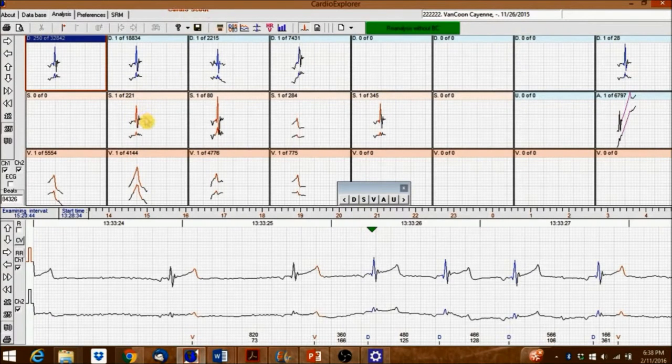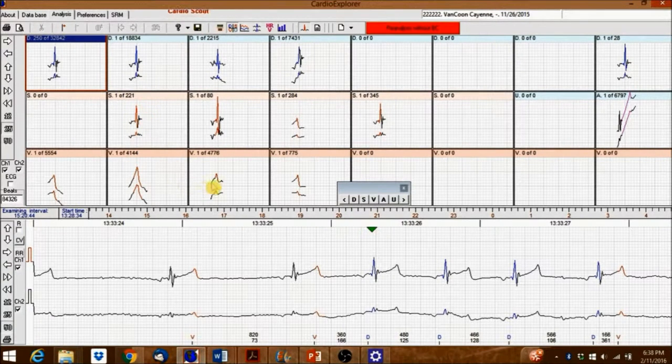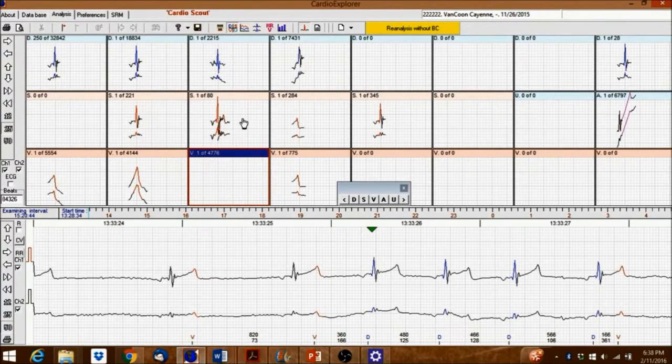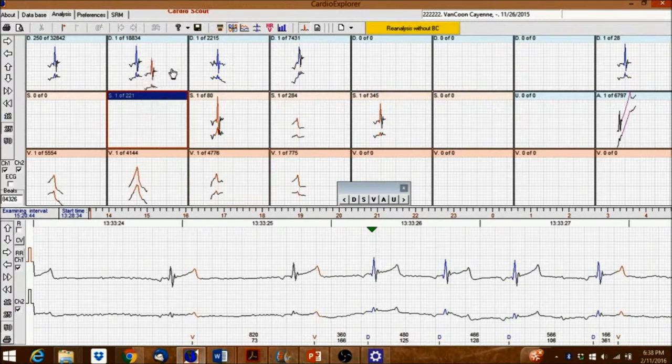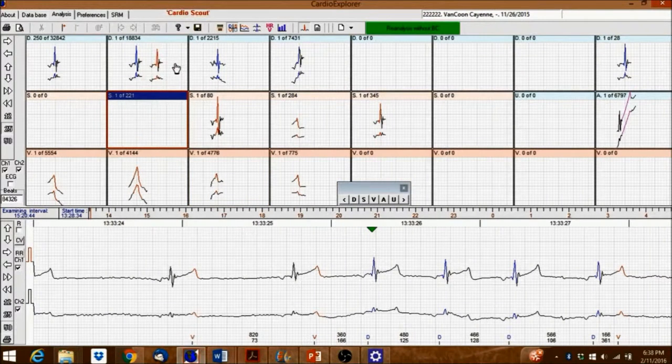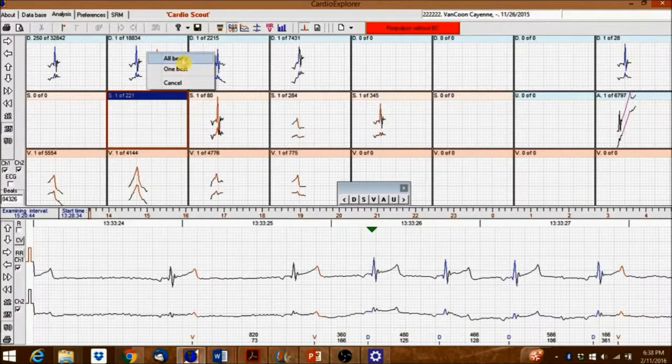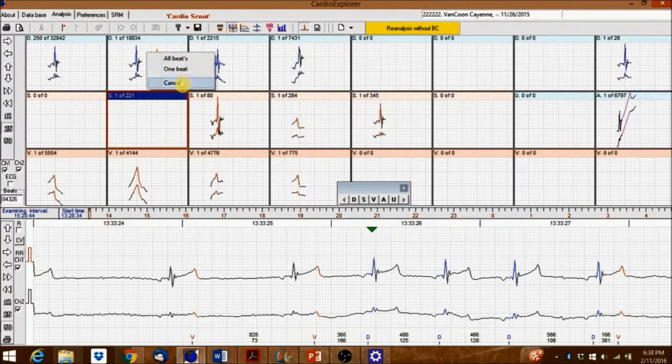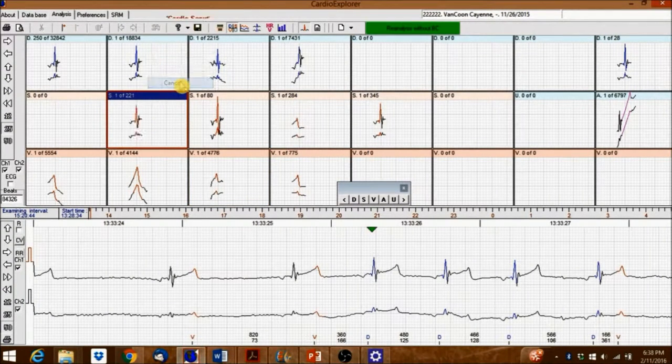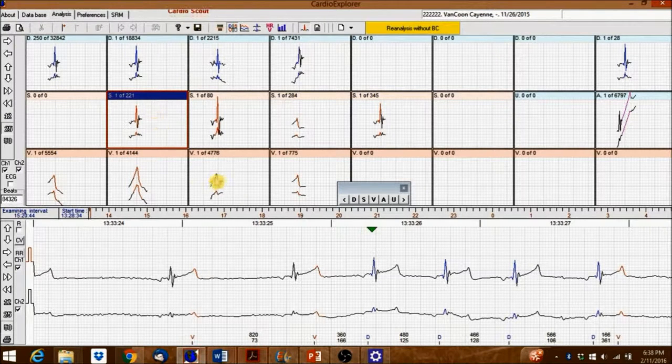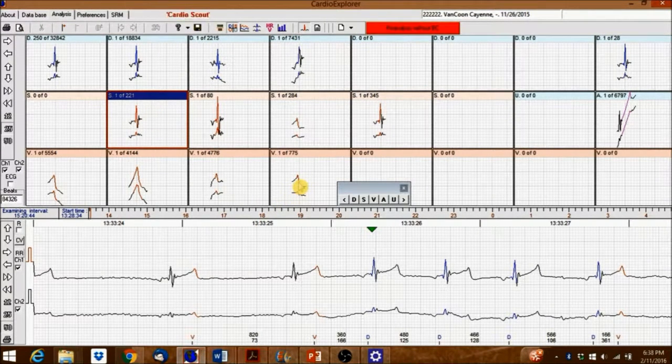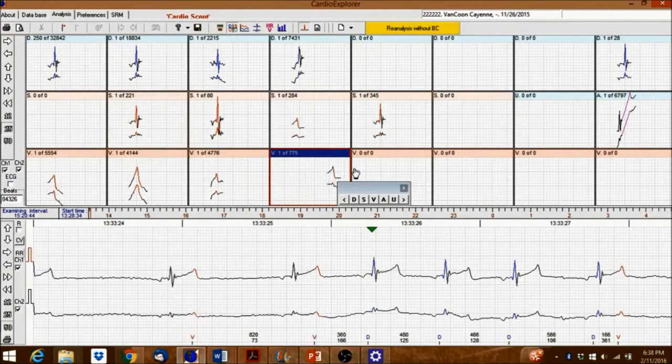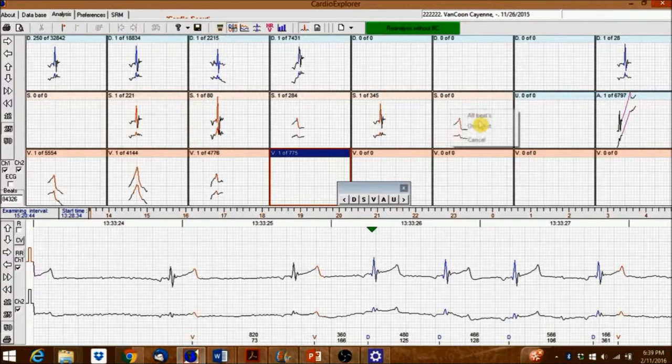Left-clicking and dragging a beat from one box into another box will prompt an all or one beat question before merging the beats. Note that moving box content will reclassify the beats.